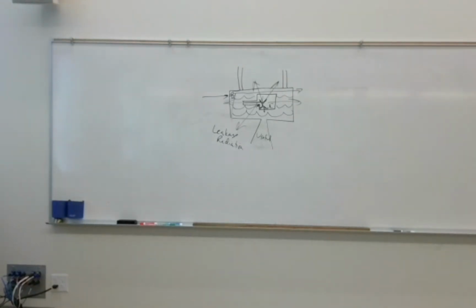So I'm going to pass the X-ray tube around, then I'm going to pass around individual components again. Remember what I said about the X-ray tube? We can't replace it. It's a vacuum tube. If you drop it and you break it, it's going to sound like a bomb went off from here.